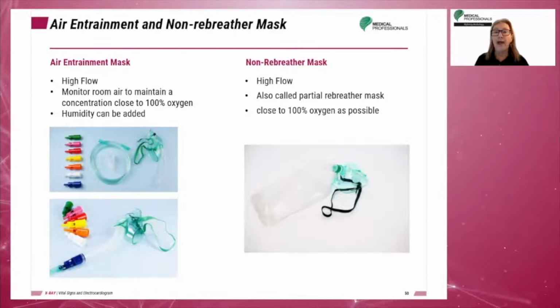The air entrainment mask is a high-flow oxygen delivery system. The system is able to monitor and control the amount of room air entering the patient's lungs. This entrainment of room air maintains a concentration close to 100% oxygen. To avoid mucosal drying, humidity can be added.